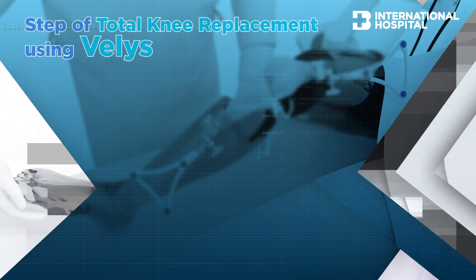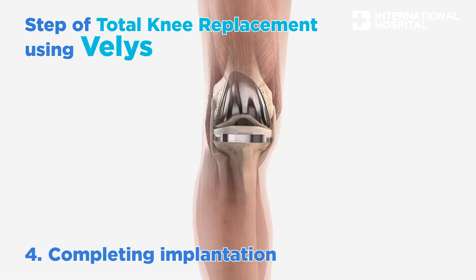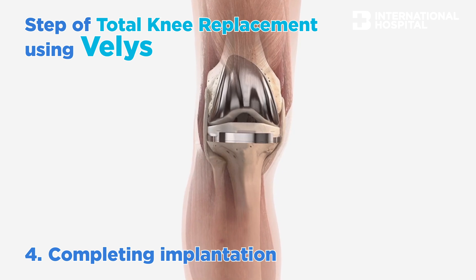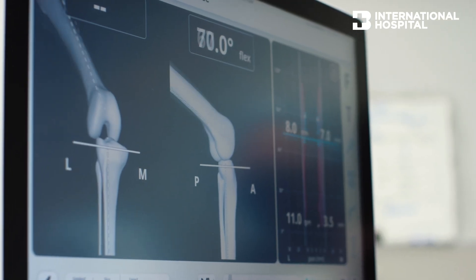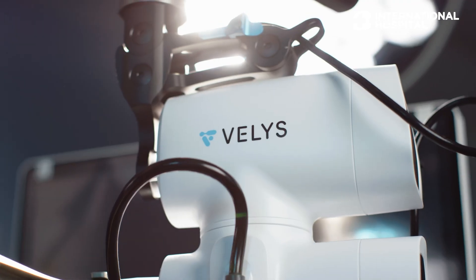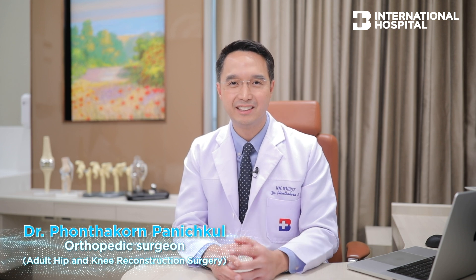When we have a good bone cut and good tension, we put the final implant inside the knee. Before finishing the operation, we use the system again to make sure that everything is in a good position and in good tension. When we have a perfect outcome during the operation, we finish the operation.